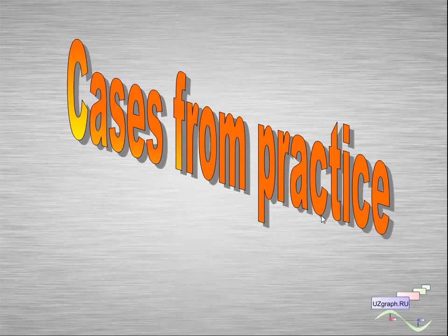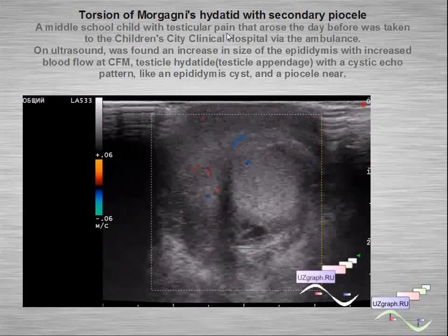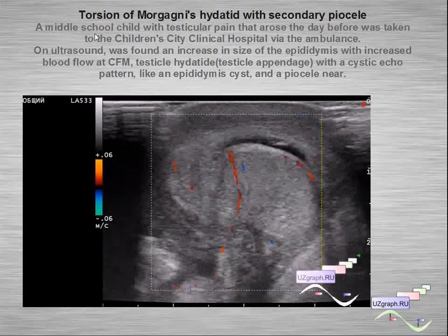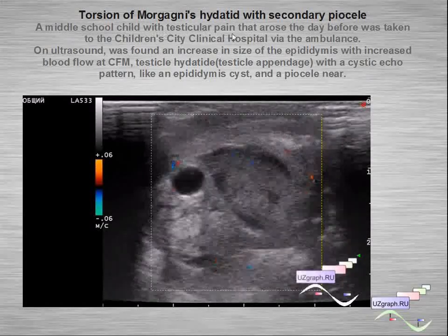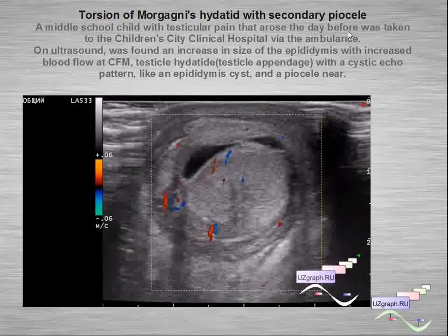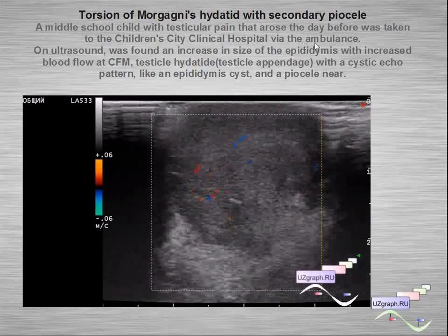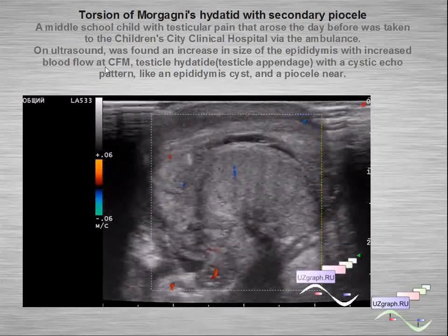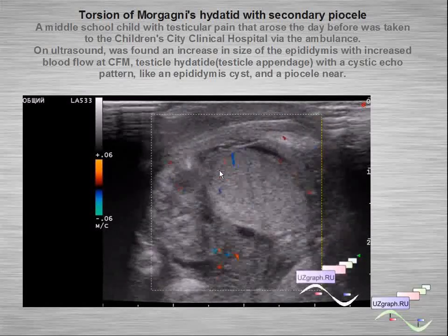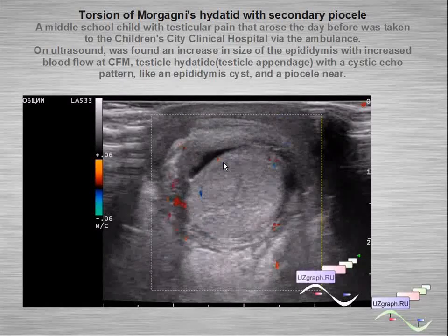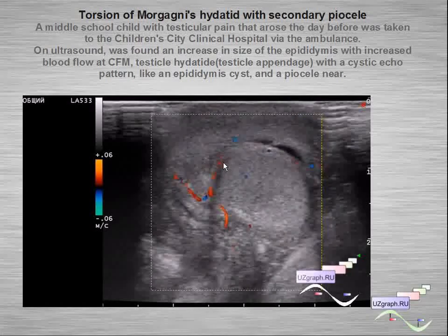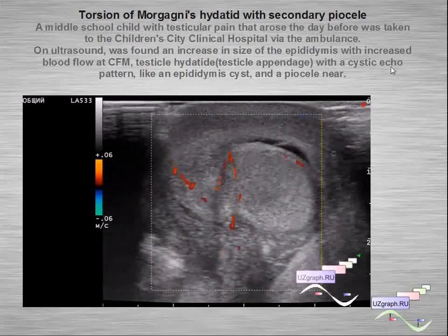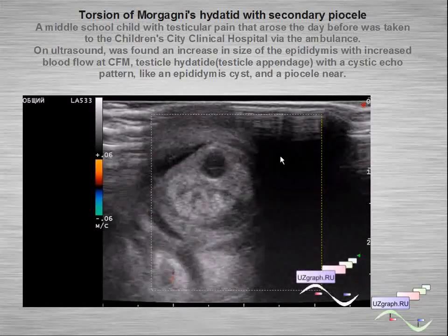A case from my practice: torsion of Morgani hydatid — testicular appendix — with secondary pyocele. A middle-school child with testicular pain that arose the day before was brought to the Children's City Hospital by ambulance. On ultrasound, we found an increase in size of the epididymis with increased blood flow at color flow mode, and a testicular appendage with cystic echo pattern. We can see it here, along with pyocele — fluid with septum.